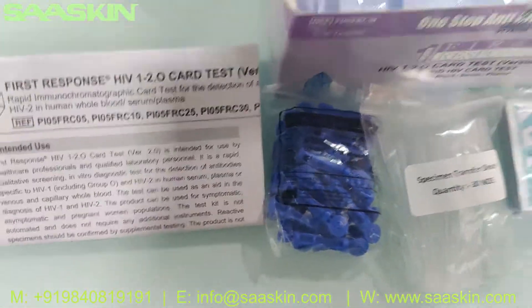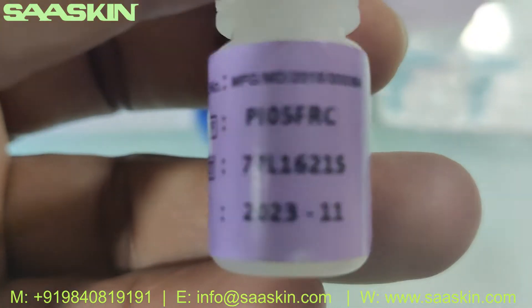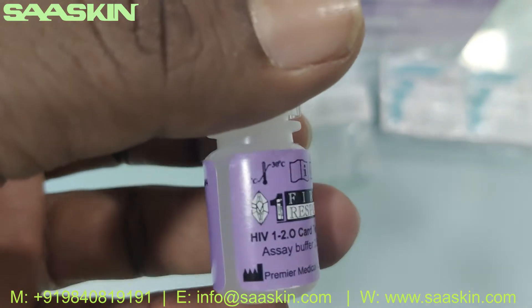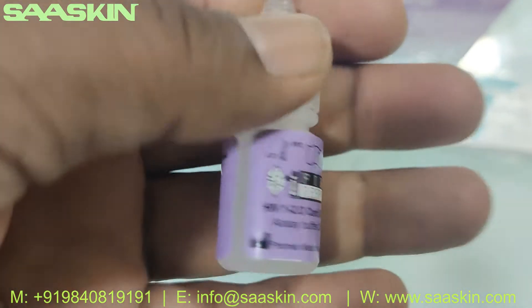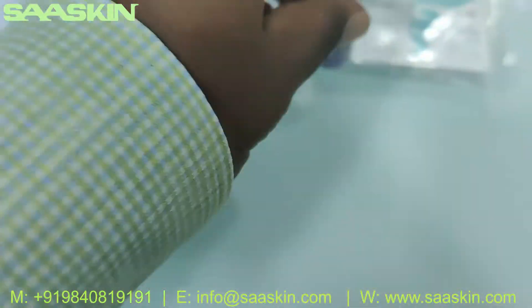And inside you get a buffer bottle — here it is. The buffer bottle is included with the kit.